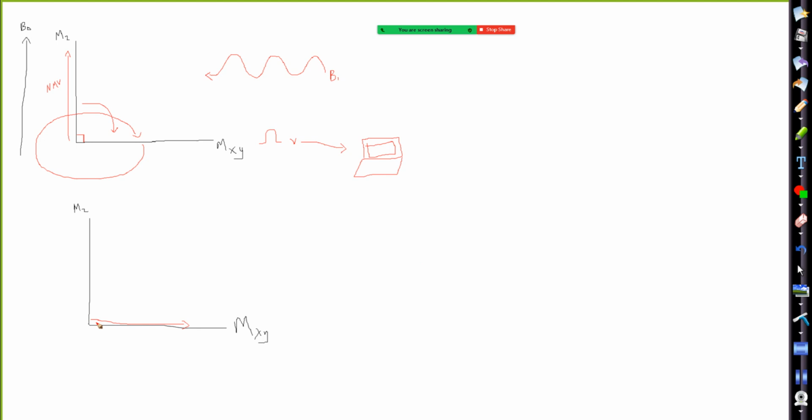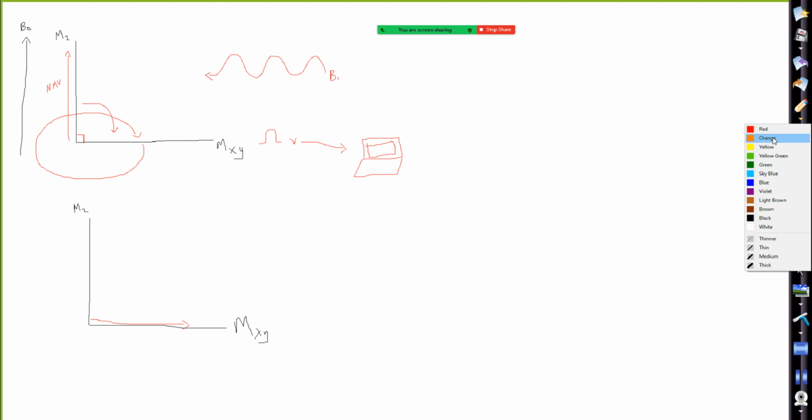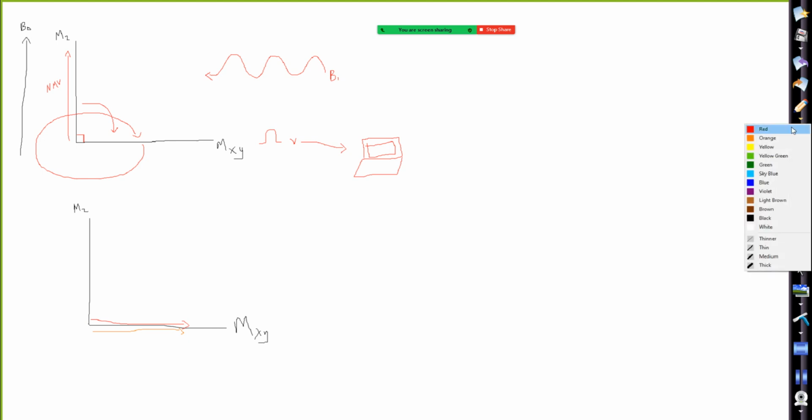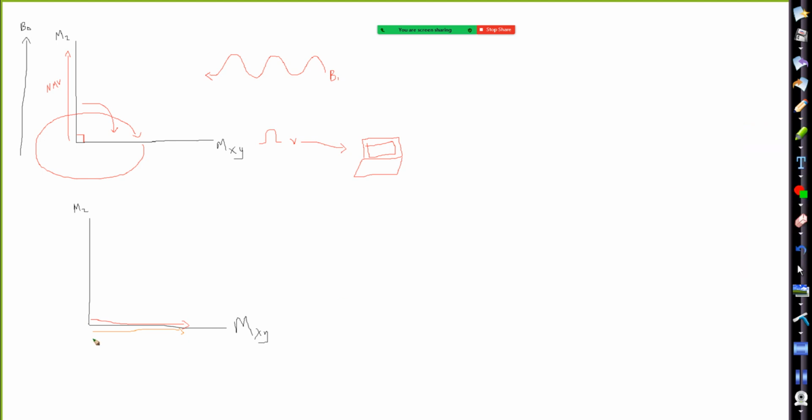Okay? We don't have really just one vector. We have vectors for CSF. We have vectors for gray matter, white matter, all the tissues in our body. Okay? And if all those vectors, and I'm just going to draw like a couple, let's give orange, that's another vector. And each color represents a different tissue. So think of it that way.